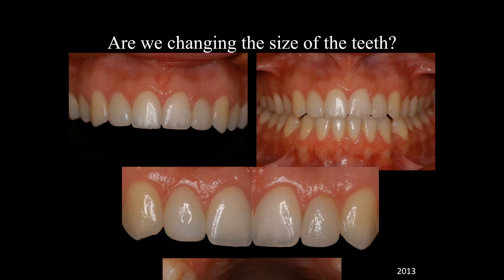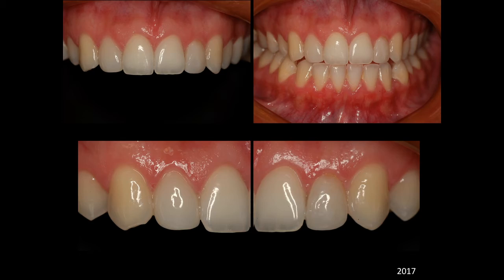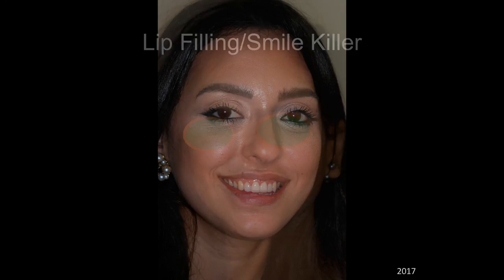Matching the color of the veneers is difficult in these situations because it will be one tooth in between adjacent teeth. Nevertheless, your close cooperation with the lab should give you a good result. And you can see the aging from 2013 to 2017 on this slide. You can see the nice aging of the veneers in this case. And this is the happy smile of the patient.